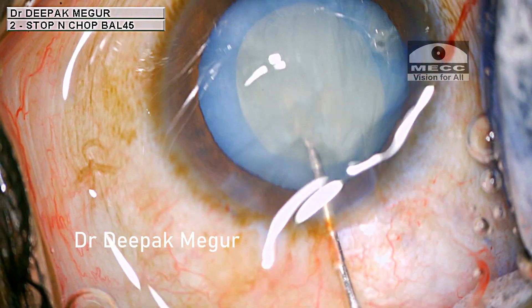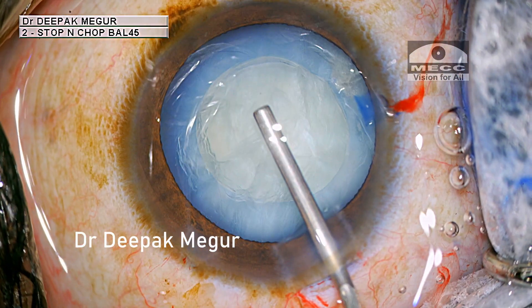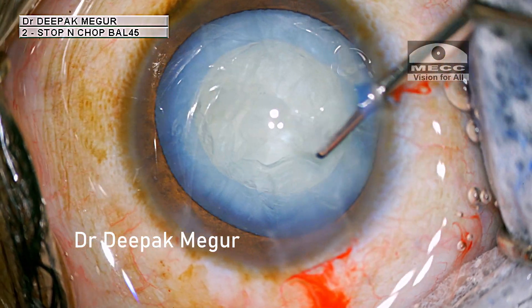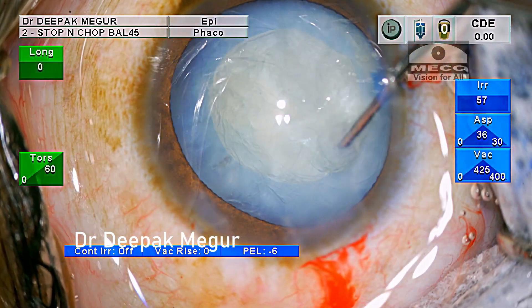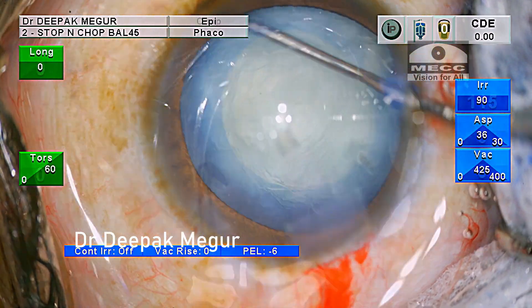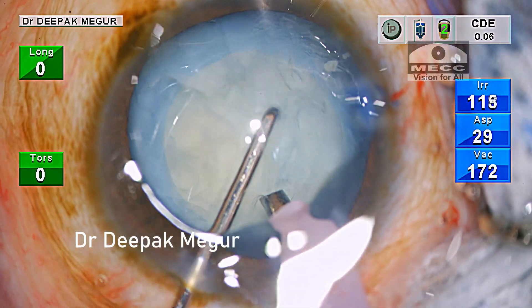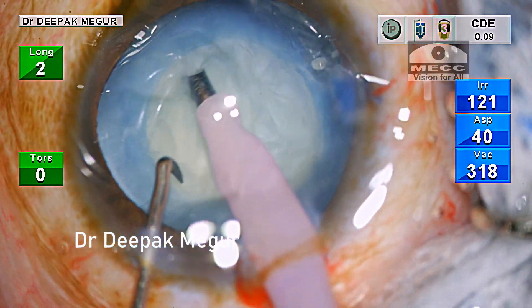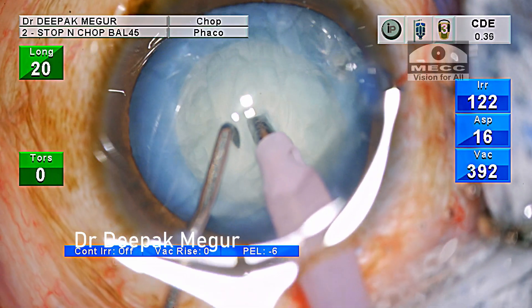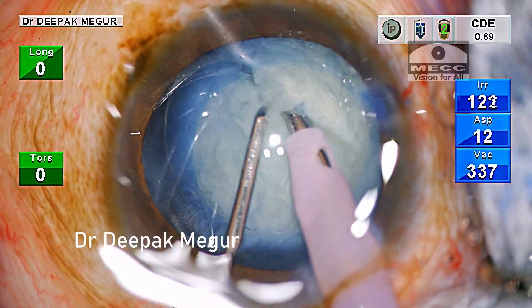Although there are marks on the nucleus exactly underneath the area of calcification, I did not read too much into it. I rotated the nucleus and it rotated effortlessly. Now is the time for phaco. I plan to perform a direct vertical chop — this is a soft cataract in a young man, so I'm using very little power, just using the vacuum to hold on to the nucleus and then chop it.